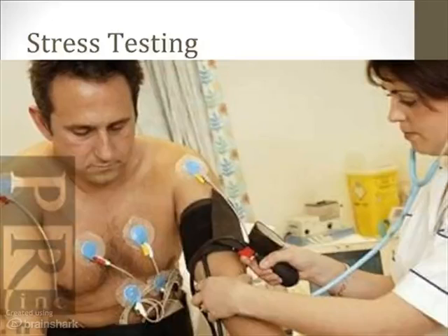An exercise stress test is a non-invasive way to measure cardiac function during physical stress. It is primarily useful in determining the extent of coronary artery occlusion by the heart's ability to meet the additional O2 demand in response to the stress of exercising in a safe environment. The patient exercises either on a treadmill or a stationary bike to increase the cardiac function or heart rate, somewhere between 80 and 90% of maximum heart rate.